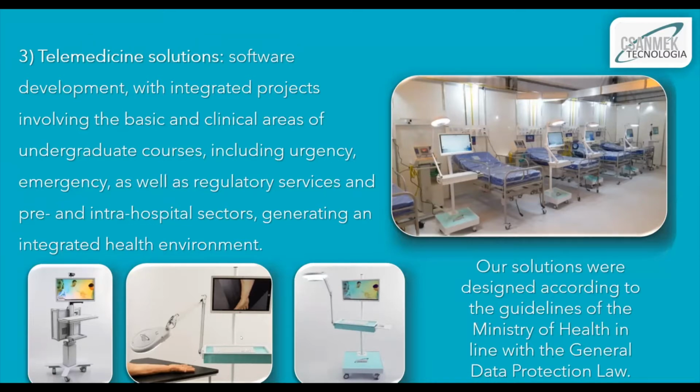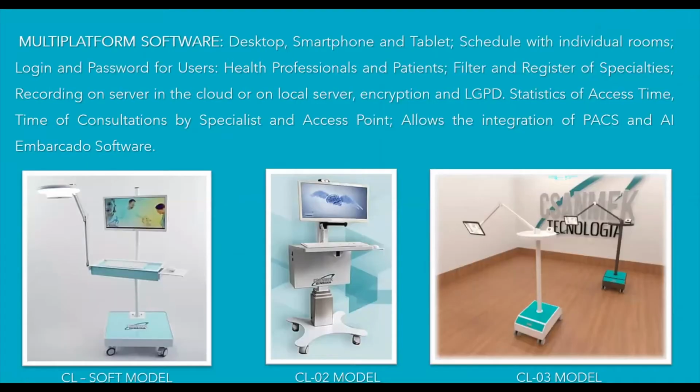The intention of this is to make the attendance to the patients more agile and definitely safer in terms of COVID. So if you have patients with COVID, they can communicate more quickly with physicians with this kind of solution. And the physicians, of course, don't need to be on site. This is the continuation of what I'm talking about. You can see the different kinds of consoles we have here.